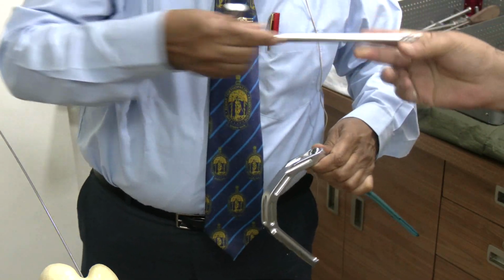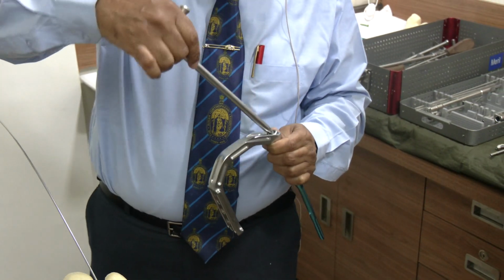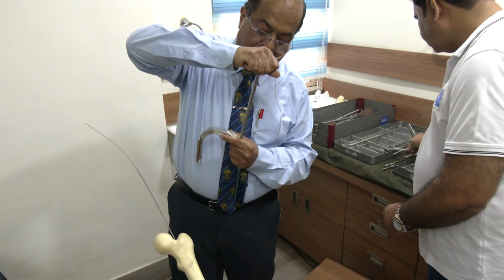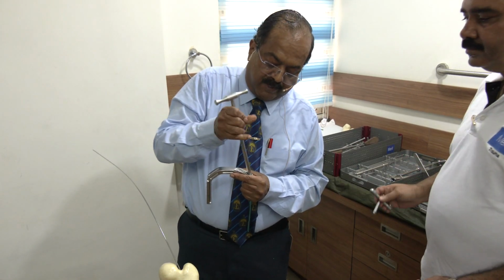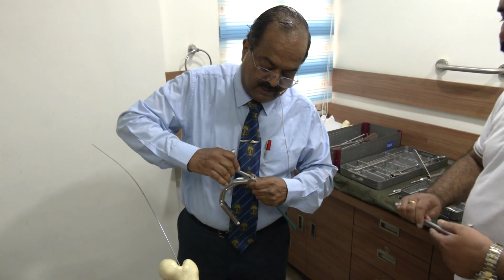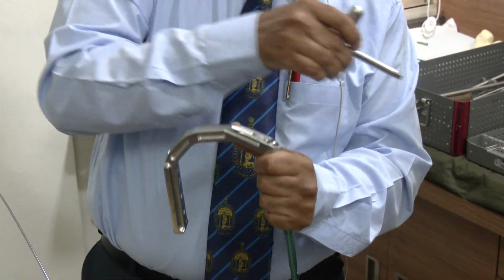For that purpose, they have made another T-handle which can be moved 30 degrees on either side. It is in the straight position now. I can keep it at 30 degrees and also unlock the screw. So both the screwdrivers are equally good, but while you are using it outside the body, it's better to use this shorter one which fits properly, exactly in line with the nail, and you compact this.